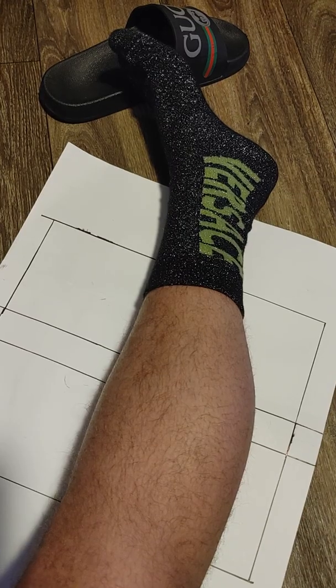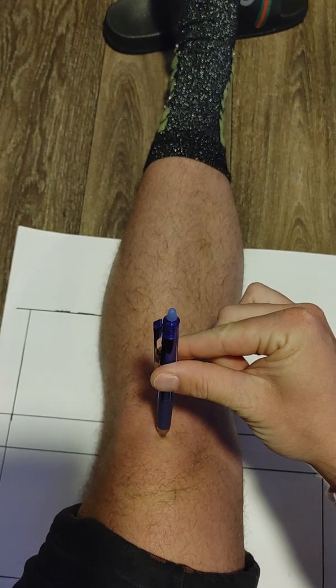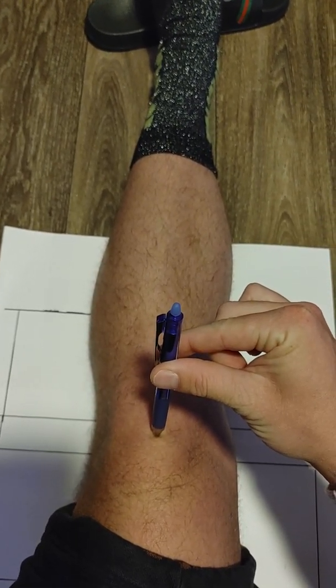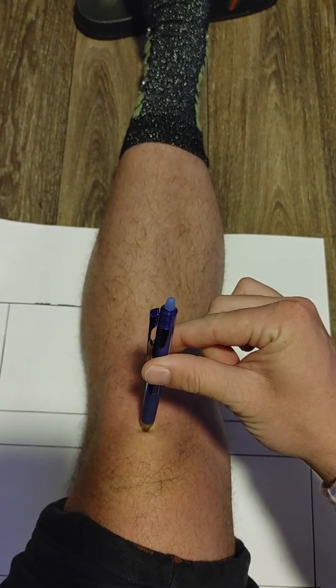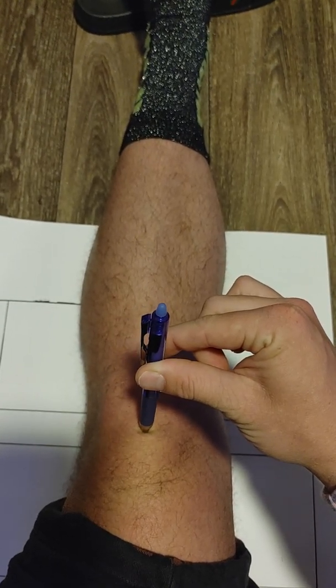Next, we have the knee views. We have an AP knee view. It's going to be like so. The central ray is going to be coming here, but instead of being perpendicular, we're going to drop it about 3 to 5 degrees. We're going to try to collimate the proximal tibia and fibula in the interspace between the tibial plateau and the femoral condyles.